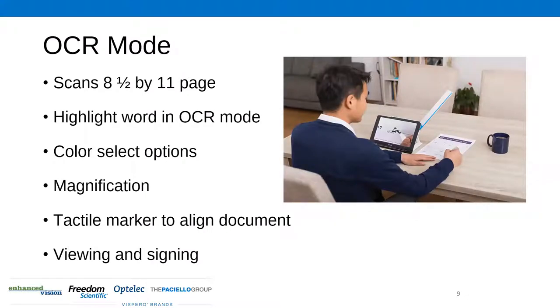The OCR mode allows you to scan an 8.5 by 11 sheet of paper, and it will read it out loud to you, highlighting the word as it reads if you want. You have different color selections to change the contrast and coloration of the reading. You can zoom into it if you want to view a live image. There's a tactile marker on the side that helps you align the document. This also comes with multiple languages. If you have something in Spanish, German, French, or Italian — there's a long list — and you scan it in Spanish and change the voice to Spanish, it will read it back to you with the correct inflection.